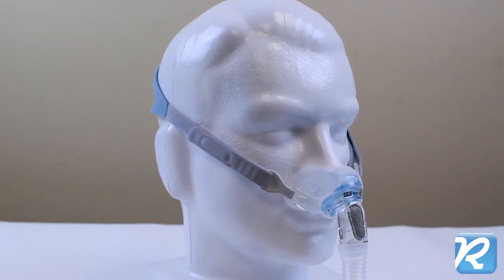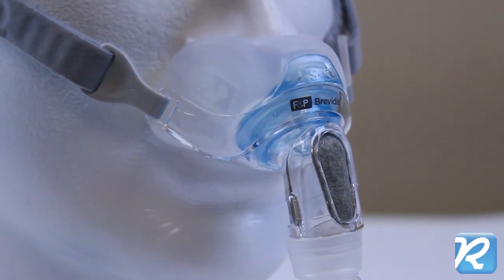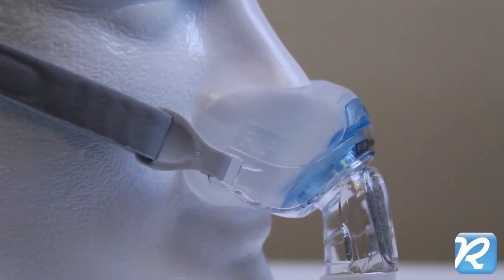Fisher & Paykel's Brevida Nasal Pillow Mask for CPAP fills with air from the CPAP machine, creating a seal unique to each user. The Brevida's pillows inflate inside the nostrils as well as around the nose.